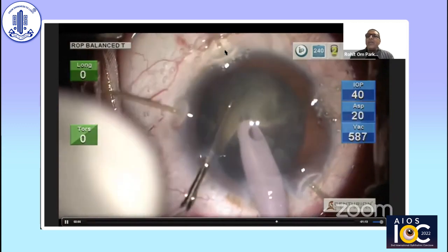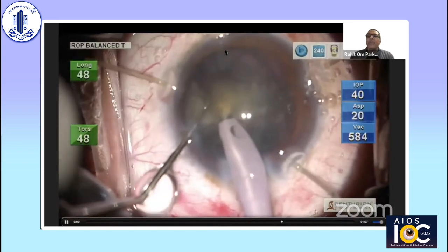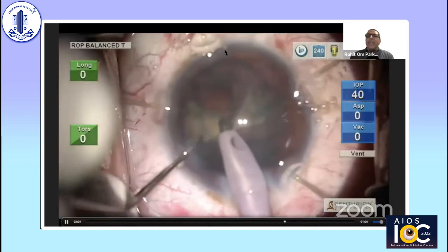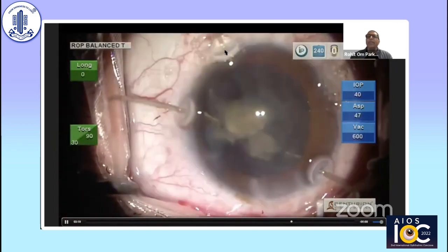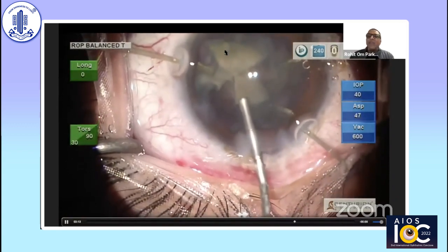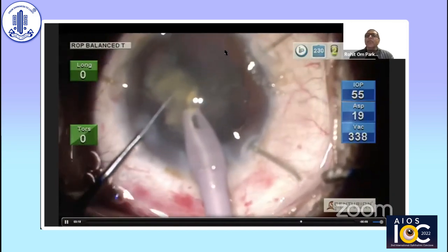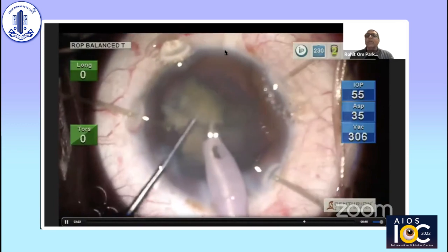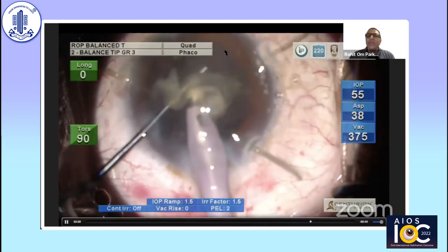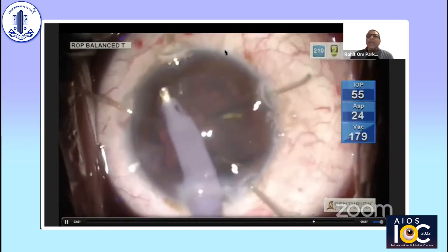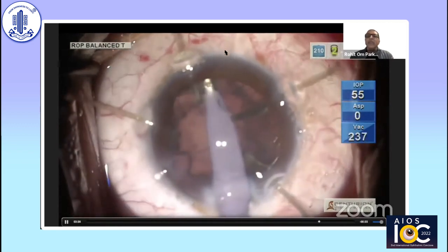Once the last nuclear fragment is being chopped, it is divided into smaller pieces and then emulsified. When the last nuclear fragment has to be taken out, I inflated the bag and protected the posterior capsule by placing the spatula behind the phaco tip, so that by any means the posterior capsule doesn't come in the way.